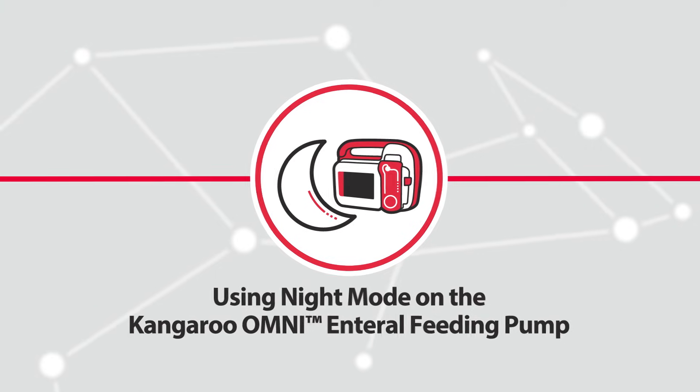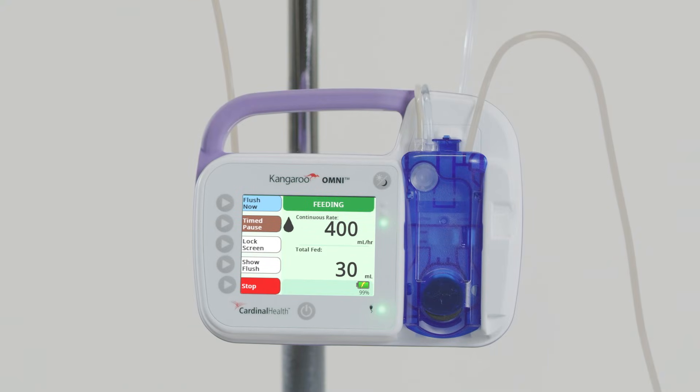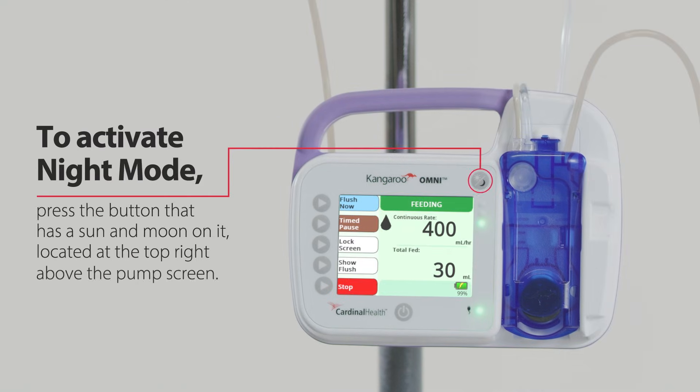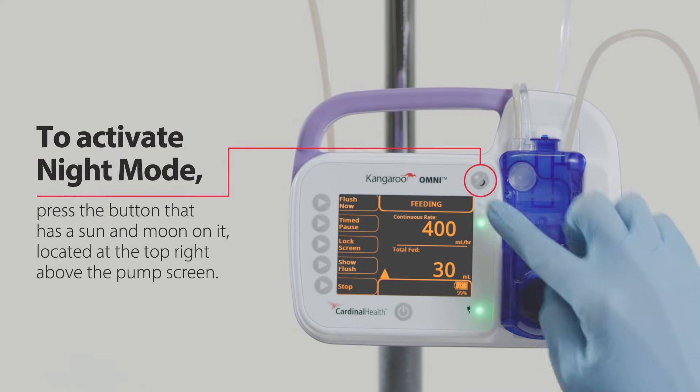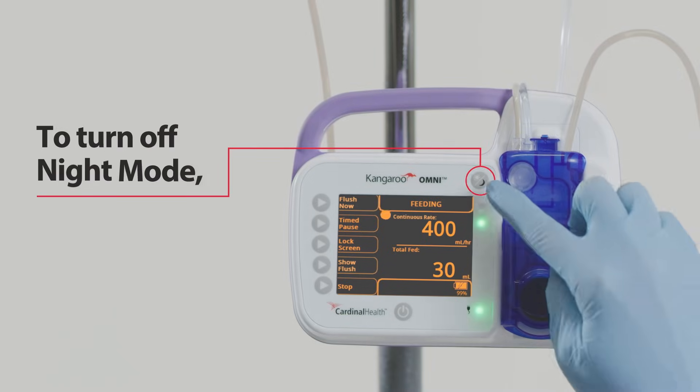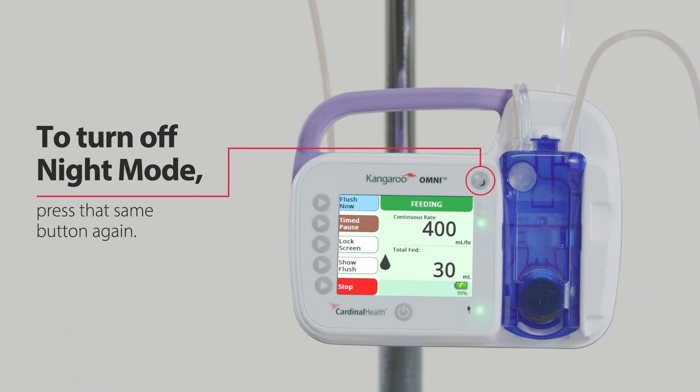The Night Mode feature reduces screen brightness by changing the display from full-color to black and orange, which is especially useful in minimizing disruption for patients who are feeding during the night. To activate Night Mode, press the button with a sun and moon on it, located at the top right above the pump screen. To turn off Night Mode, press the same button again.